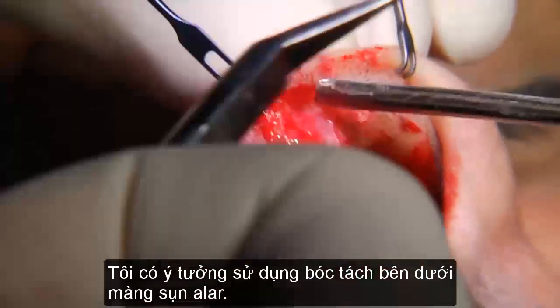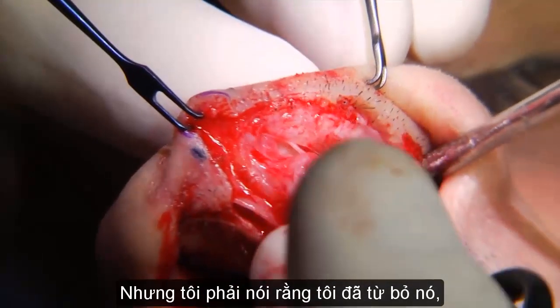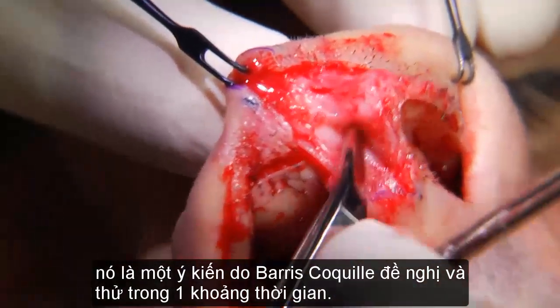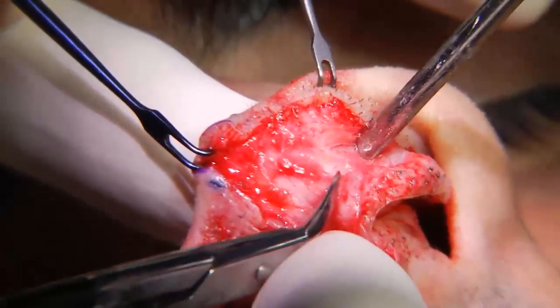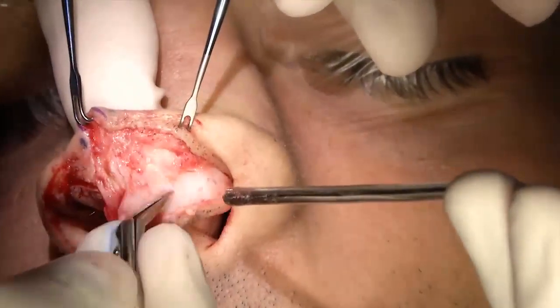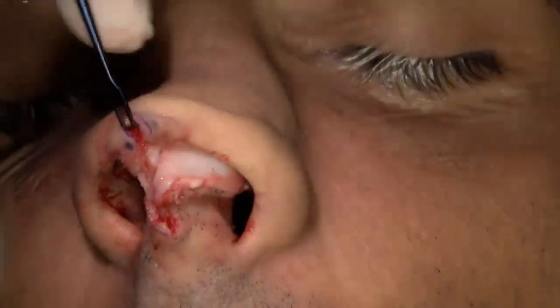So I have played with the idea of doing a subperichondrial dissection of these lower laterals, but I have to tell you I abandoned it. It was a thing that Boris Kakir had suggested. Rohrich tried it for a while. You can actually already see the shape of these cartilages.